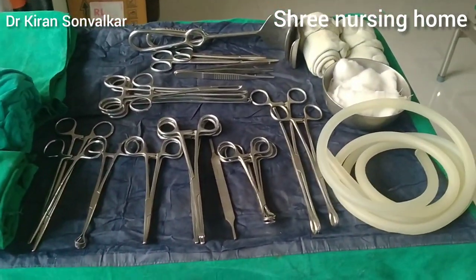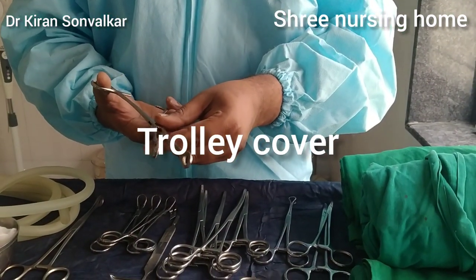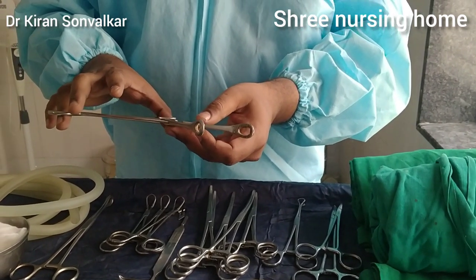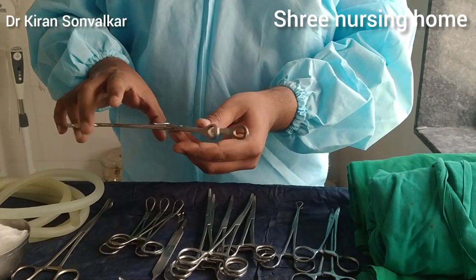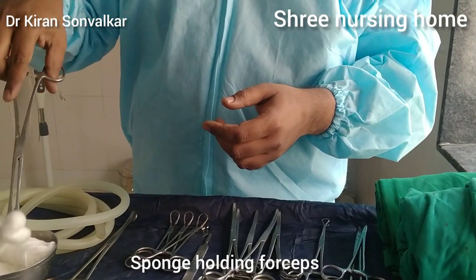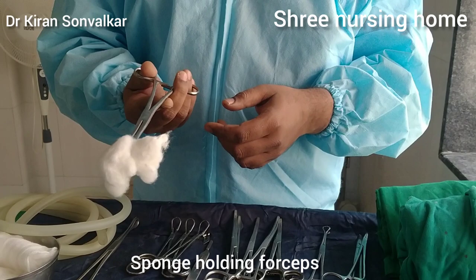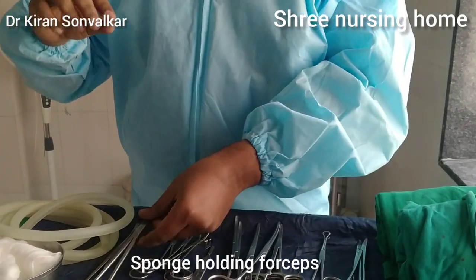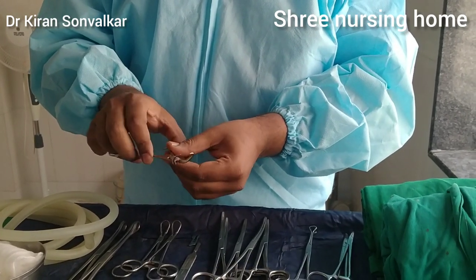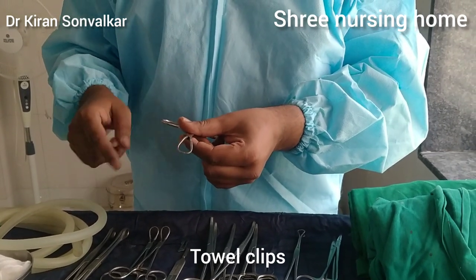The first one is this trolley cover, and sponge holding forceps, used by anesthesia obstetricians for cleaning and painting. With sponge holding forceps, they take sponge or cotton and do cleaning and painting with betadine and spirit. The next one is towel clips, required to fix towels, drapes, and also to fix suction pipe or cautery.